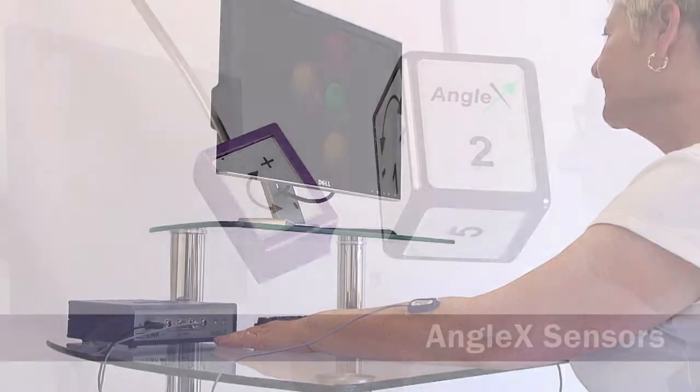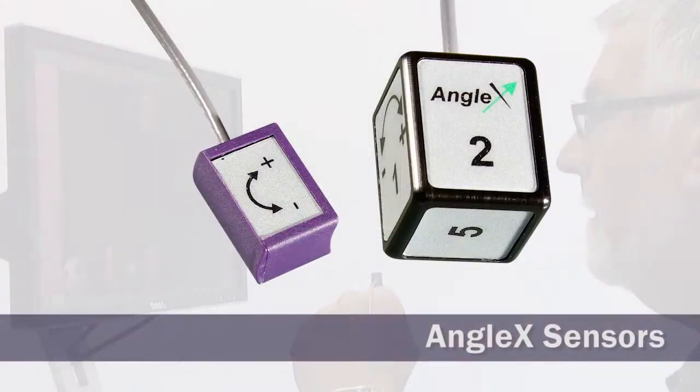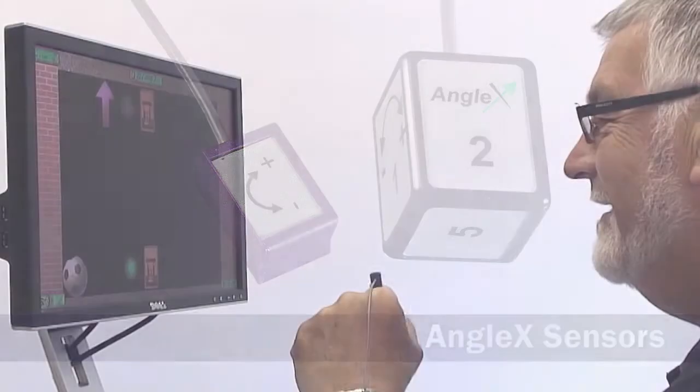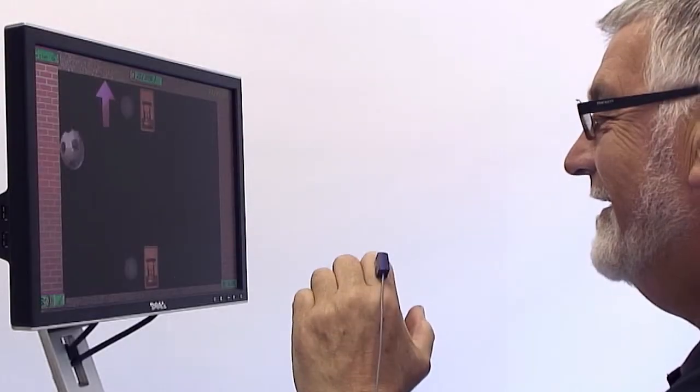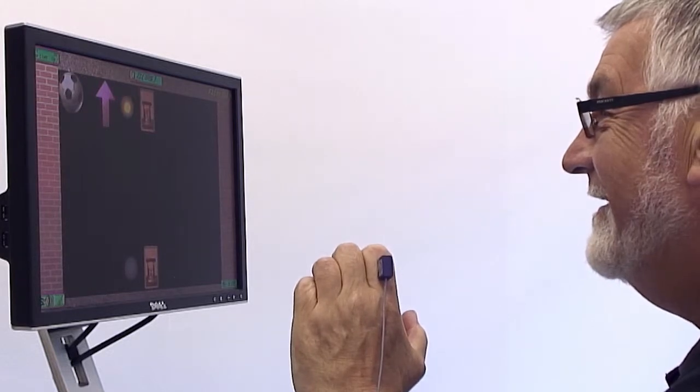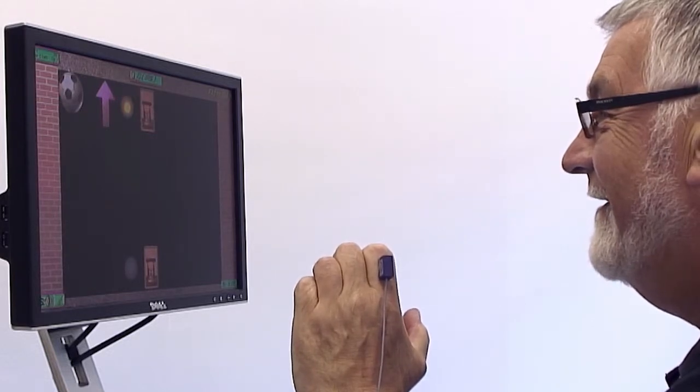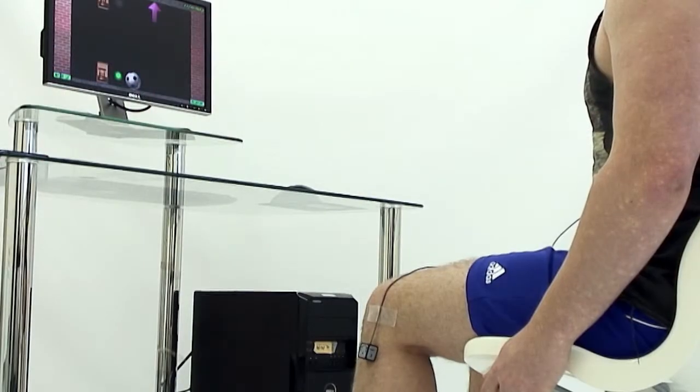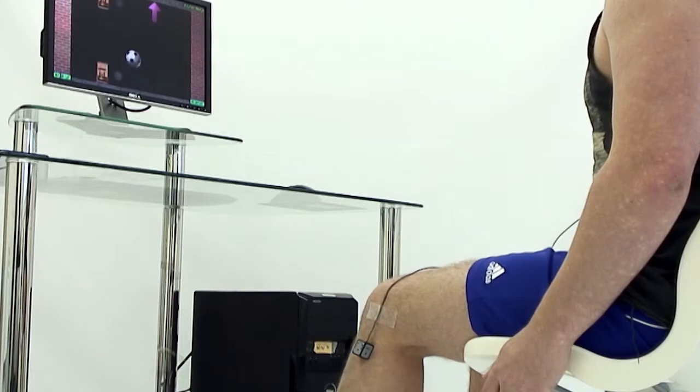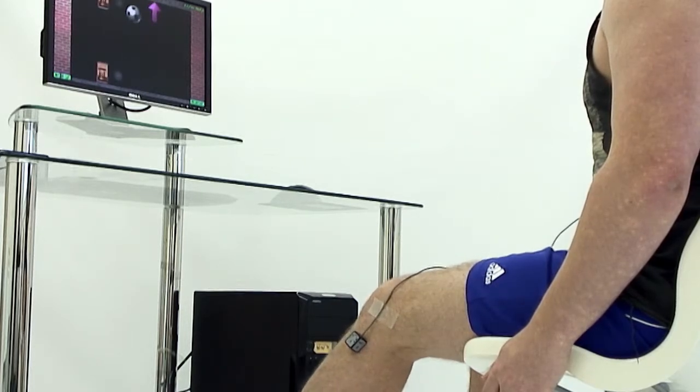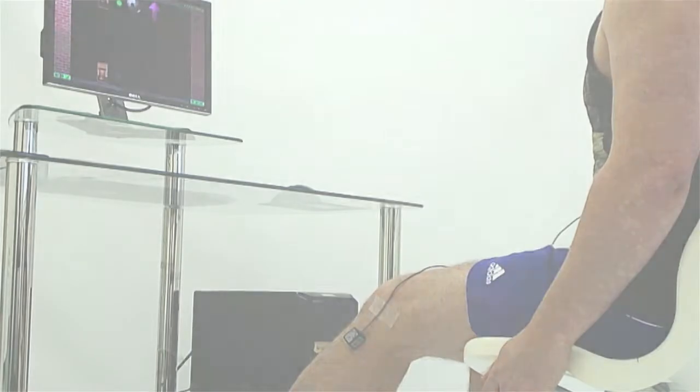Where there is active joint movement, AngleX sensors detect and encourage focused exercise against gravity for even the small DIP joints through to the larger joints of both the upper and lower extremities.